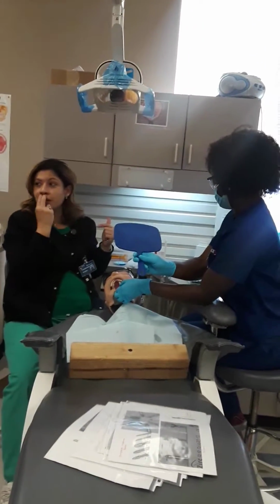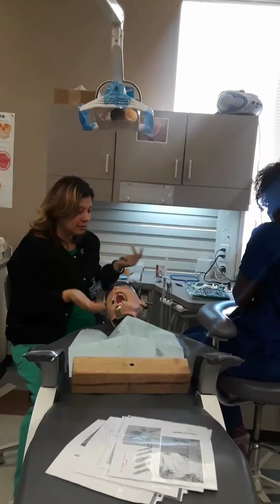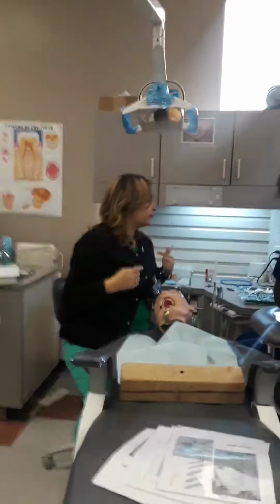Yep, ask the patient, see if they like it, especially if it's a front tooth. Remember how you would feel about a front tooth filling? They're going to feel the same way. Let them approve it. Fine. It looks good. What shade did we get?